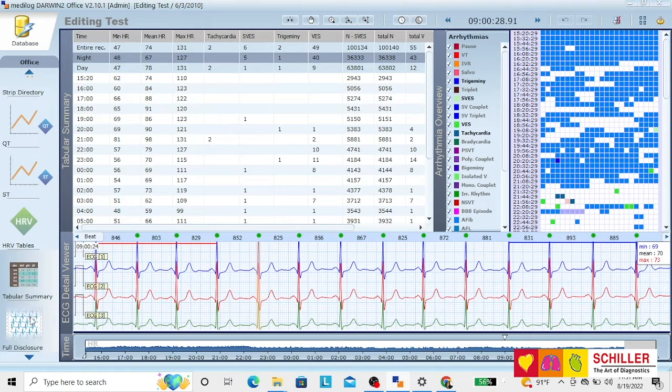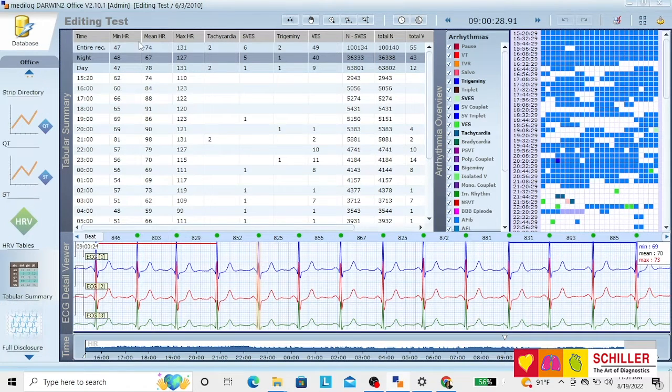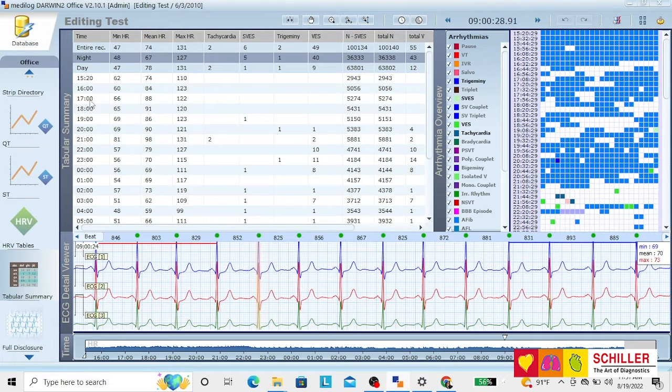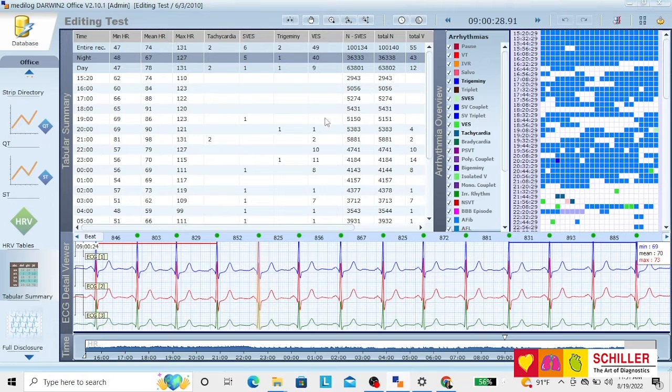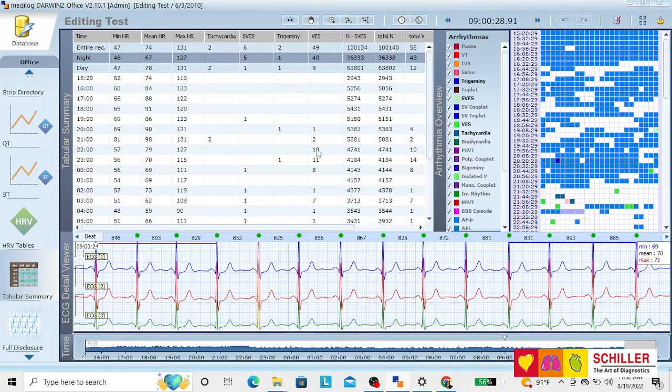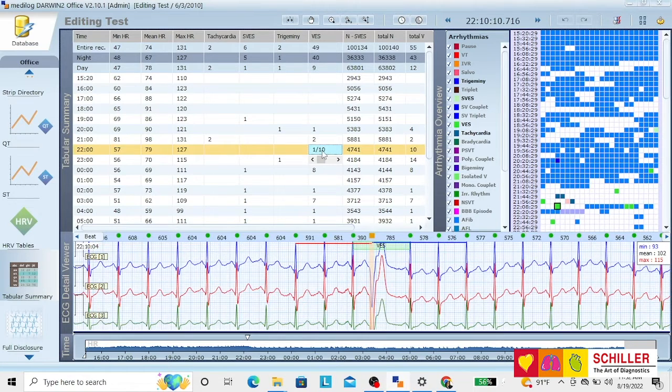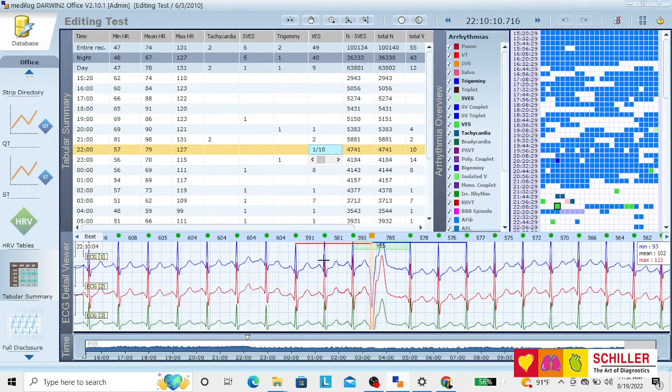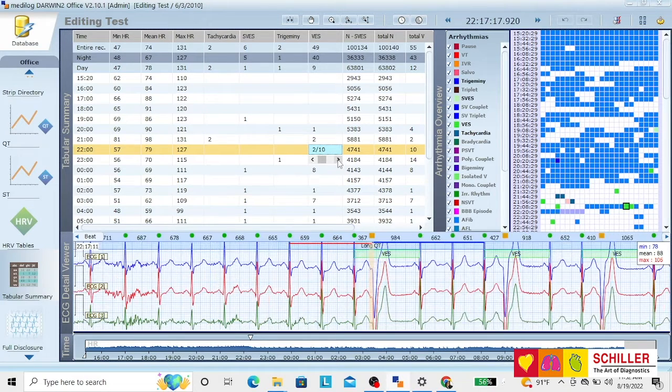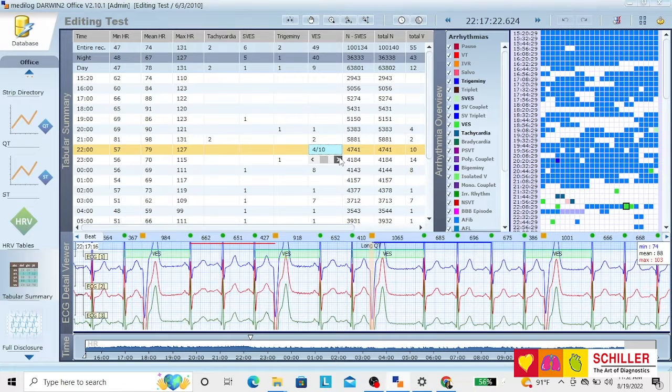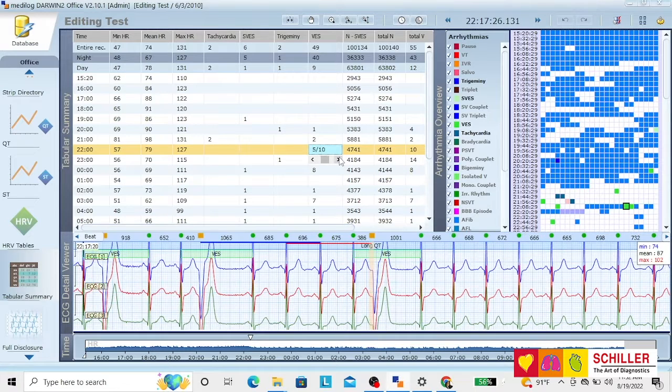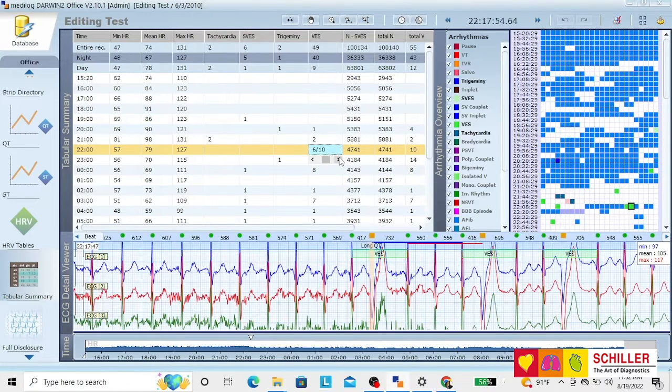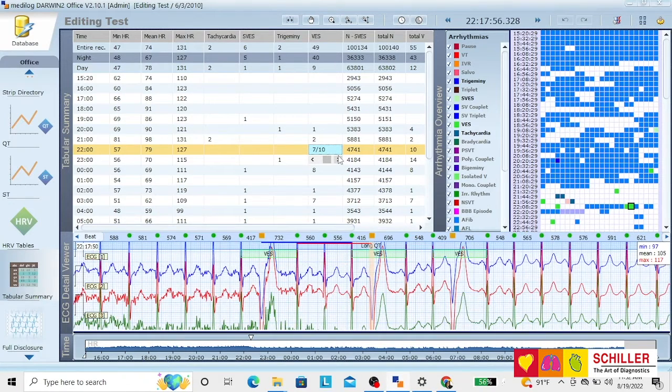When you go to your tabular summary, you will have all the events happening hourly. You just click on the events that you see here, let's see, 10 ventriculars, and when you click there, you see that it opens a strip, and you can review them one by one without any trouble.